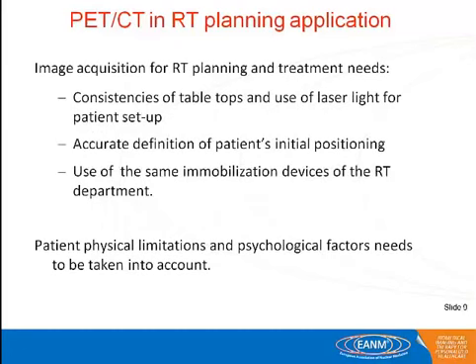Now, image acquisition for RT planning and treatment needs. We need consistency of tabletops and the use of laser lights for patient setup. We have to be in the same situation as the treatment. There needs to be a definition of the patient's initial position, so we know how the patient will be positioned for the radiotherapy, and we do the PET-CT in the same position. We also have to use the same immobilization devices as the radiotherapy department. They bring their immobilization devices, and we use them with our PET scanner.